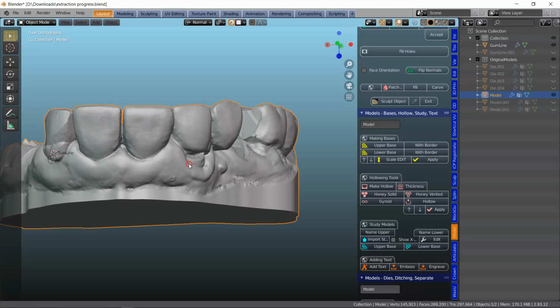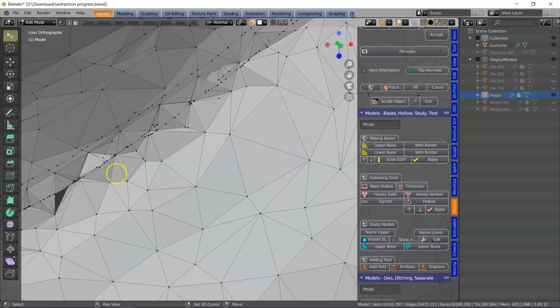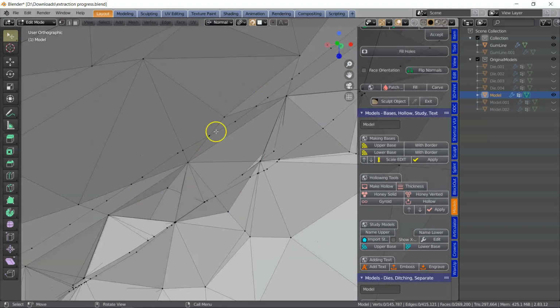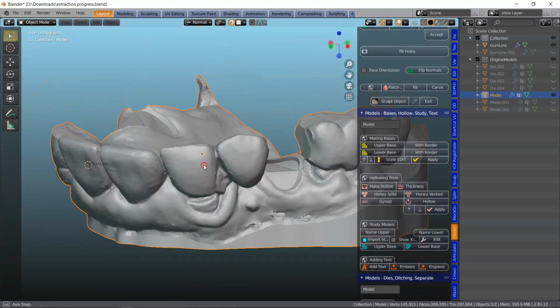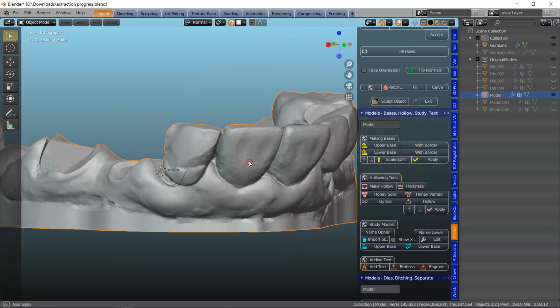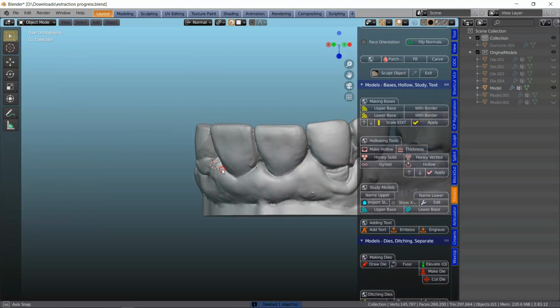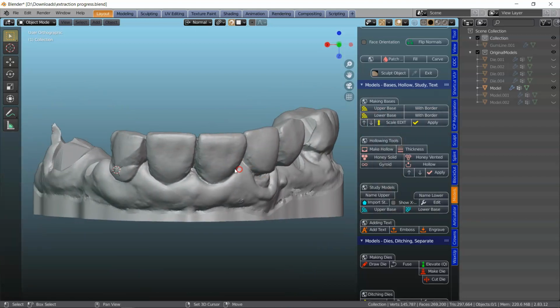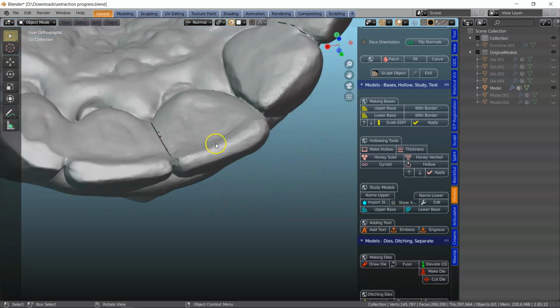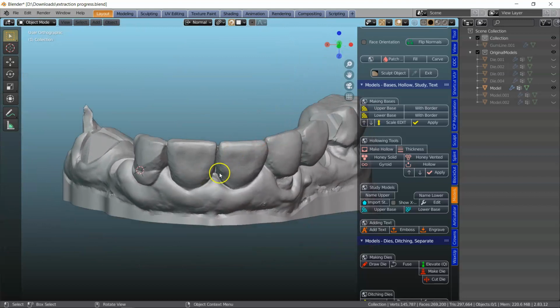This is a bit of a problem because you can see all of these vertices. It's not going to separate out if you create another Boolean tool cut. So I'm not quite sure. You've obviously tried to do each and every one individually, and if you're doing the whole section, why don't you just do the whole section, or half the section and then the other half? In this example now, it's very difficult to fix this.